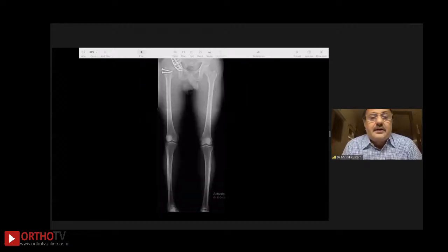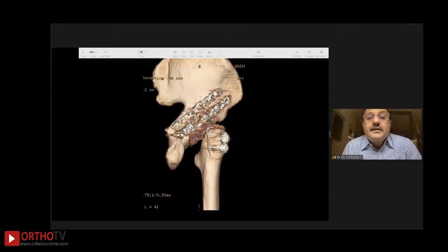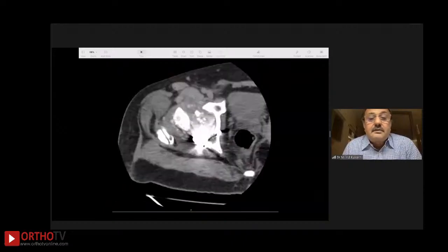Clinically, laboratory. And so, of course, we do all this CT mandatory, 3D implants. And this shows that on day one, the acetabulum, the implants were perforating. So the acetabulum was going. It was getting bad. So now, however good software you have, the metal is going to give you artifact. And the main thing is the posterior wall is deficient.